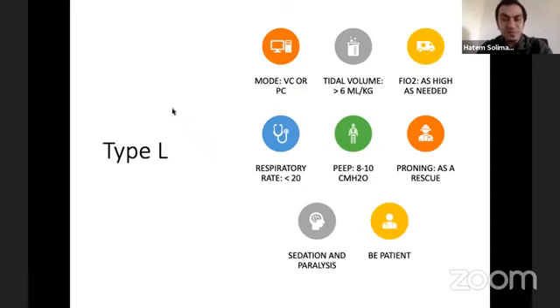And I think the most important message I want to give from this presentation, one thing, be patient, because one of the very dangerous and one of the very bad consequences of ventilation management in these patients is our temptation to wake them up early when we see the FiO2 improving down to 35 or 40%.